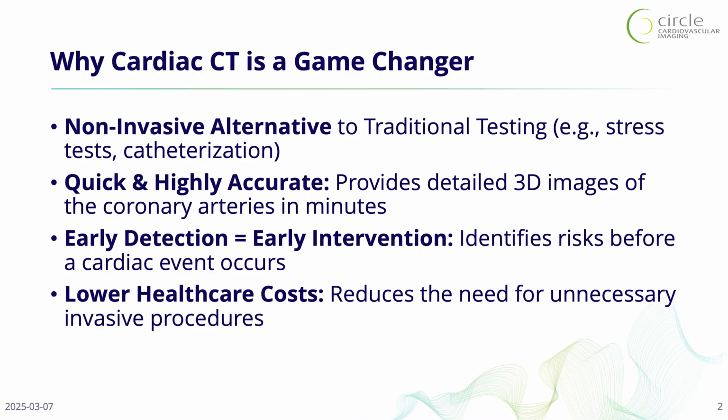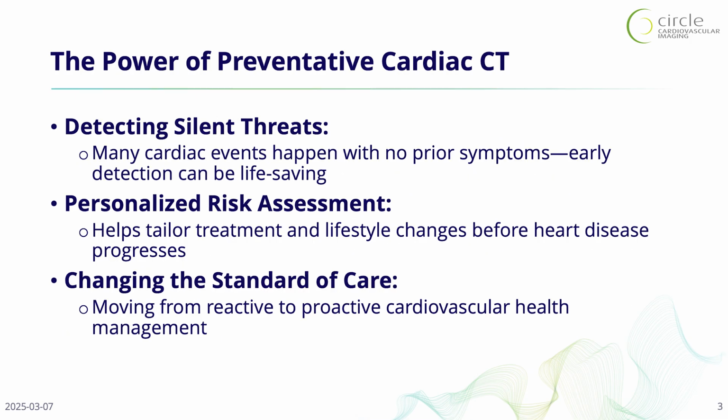And with early detection and early intervention, we can identify this risk before any cardiac event occurs and lower the healthcare costs. So we reduce the need for other unnecessary or invasive tests. And we talked about that before. So this is the power of preventative cardiac CT, detecting the silent threats. Many cardiac events, again, occur with no symptoms.